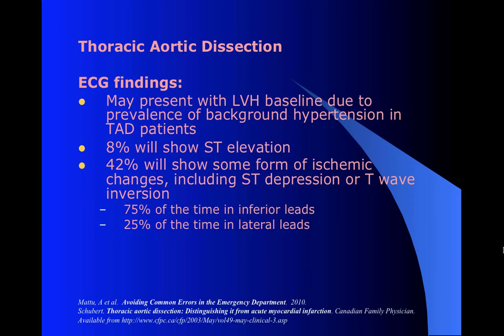Now on the EKG, what are you going to see? Nothing very specific. A lot of them may have an LVH appearance just because a lot of them have hypertension, which can lead to the LVH. It's not like it causes dissections, but it's a risk factor. A few of them will have elevation.